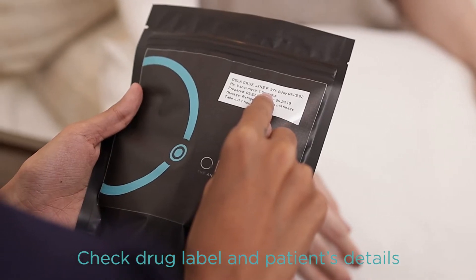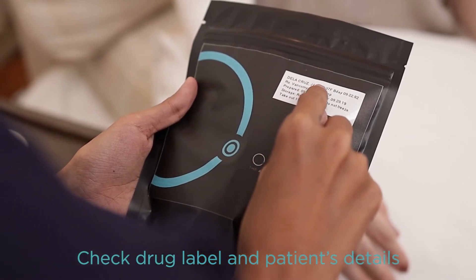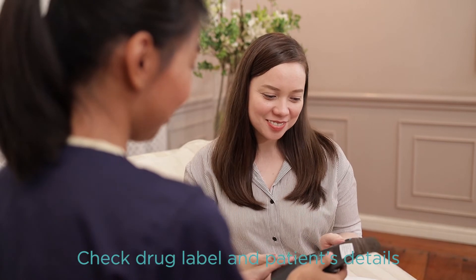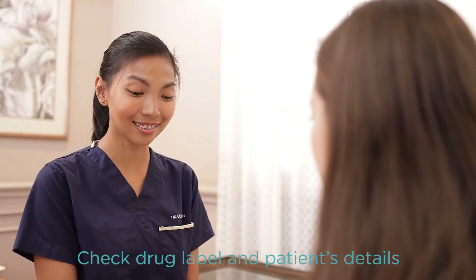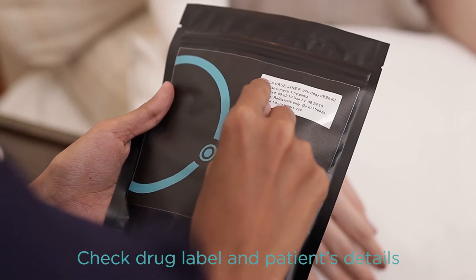Next, check your antibiotic medication by making sure that the drug label is correct. Check if the patient's name, patient's age, patient's birthday, name of medication, dosage of medication, and expiration date are all correct.